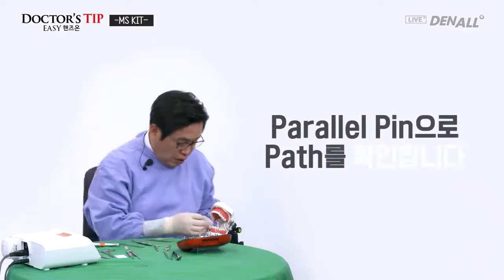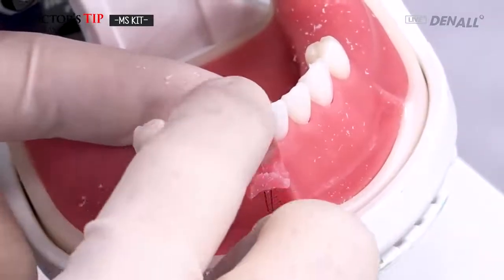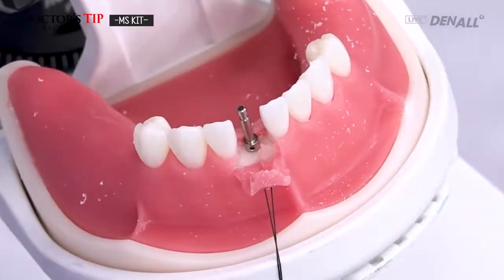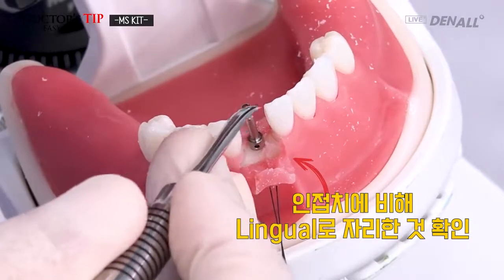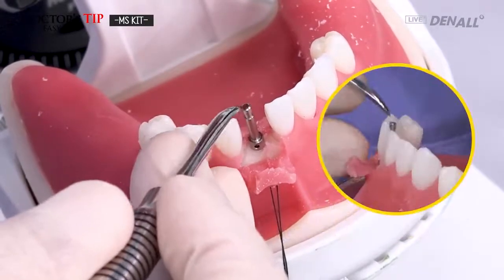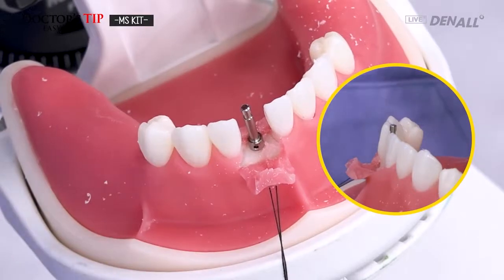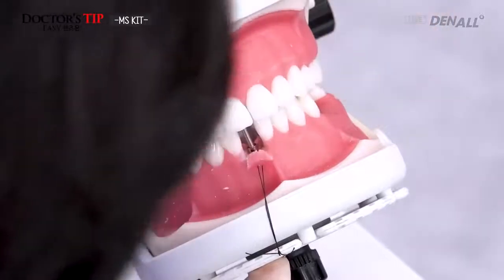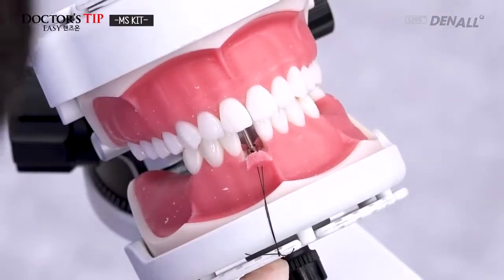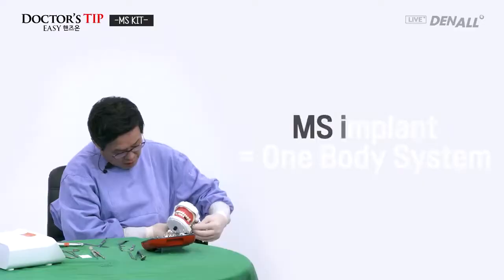I used a parallel pin to check the drilled position, and as you can see, on the mandible anterior side, compared to adjacent teeth, it's tilted about 0.5 to 1 millimeter toward the inside. And like this, you check the positioning, and on the upper side, on the lingual side, it's the correct position.